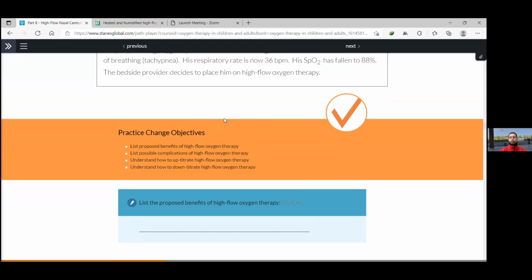There were issues mentioned, like avoiding intubation. I think our participants are understanding this in the context that if we initiate early high flow nasal oxygen therapy, maybe the need for invasive ventilation can be prevented. But once it's too late and the patient starts to collapse, then there's no way to put the patient on any form of ventilation other than invasive ventilation. So in our setup, we lack most of the time high flow nasal therapy or even non-invasive ventilation. So we put patients on a face mask with a reservoir, and they stay there for a very long period of time. There is not even any escalation.